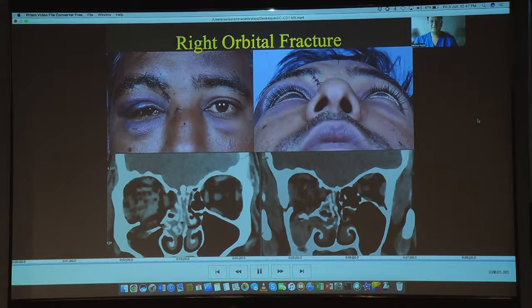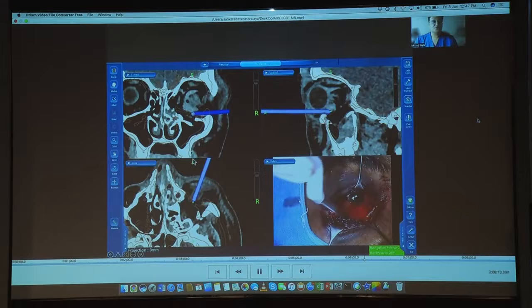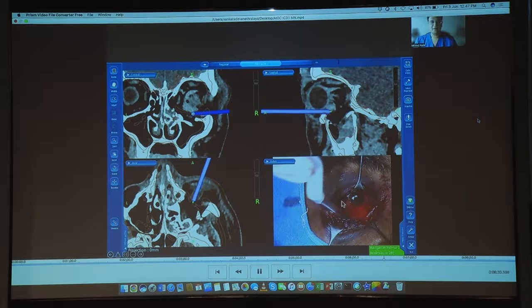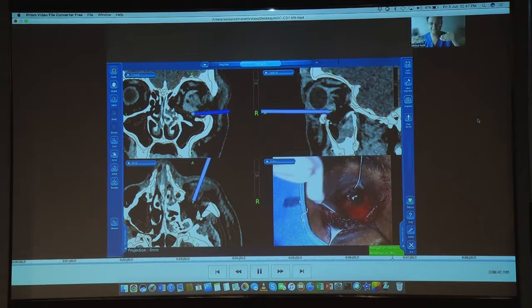Similarly, mirroring technology is very useful with navigation. Here is a patient with a right floor and medial wall fracture with the inferomedial orbital strut disrupted. On these images you see a faint red outline — these are actually mirror images from the normal contralateral orbit, indicating where the ideal location of the floor or medial wall should have been. When we place the orbital plate, we place the tracker on it and confirm whether it is matching the markings from the other orbit, ensuring both floors are at the same level after repair.